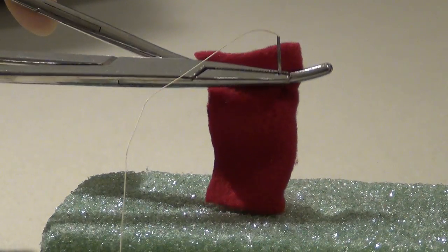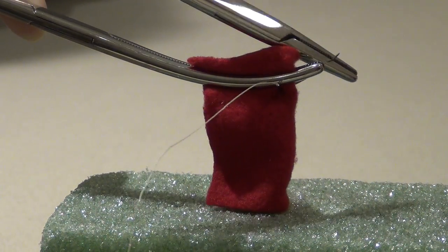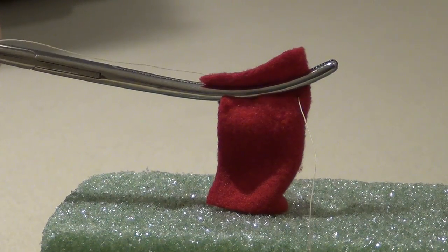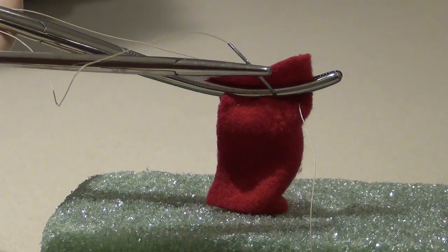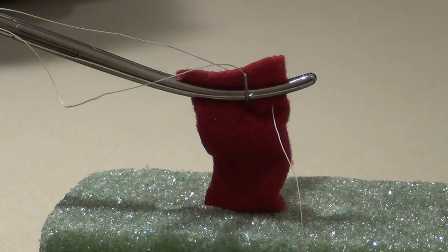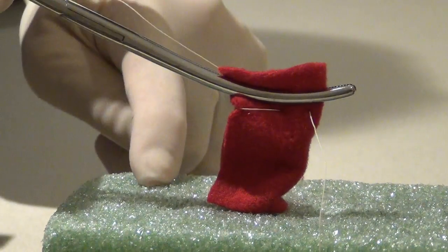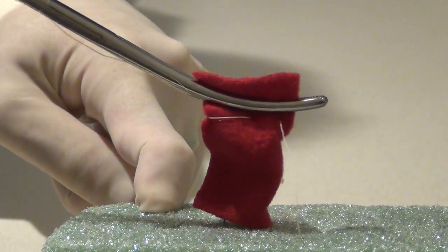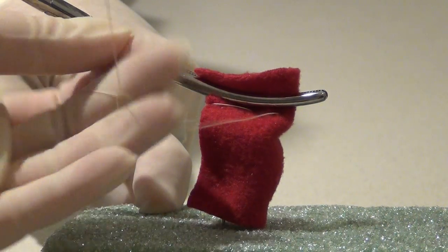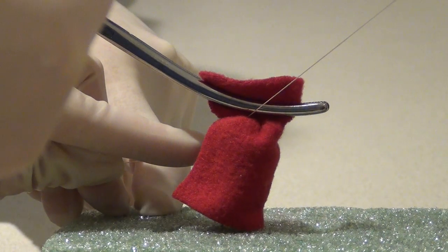In a Haney stitch, the suture is first placed at the tip of the clamp at the front of the pedicle. The suture is then removed and brought around behind the back of the clamp. The suture is again placed through the middle of the pedicle under the clamp. It is taken all the way through and the ends of the suture are brought around behind the back of the clamp. A knot is tied down at the back of the pedicle and as the knot is tied down, the clamp is removed.